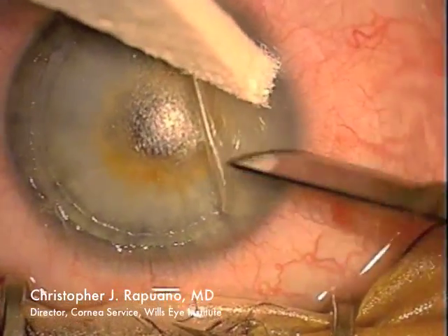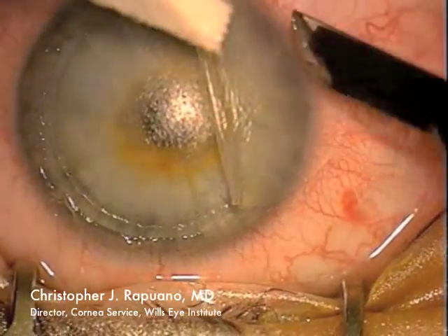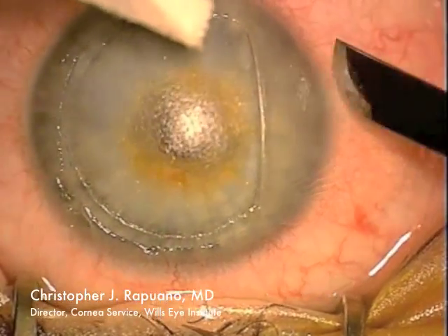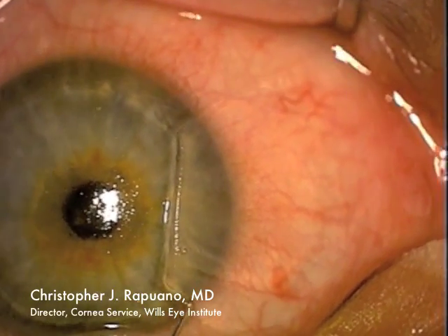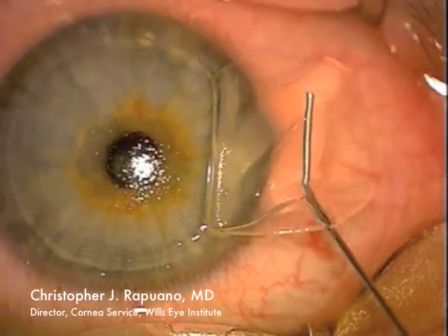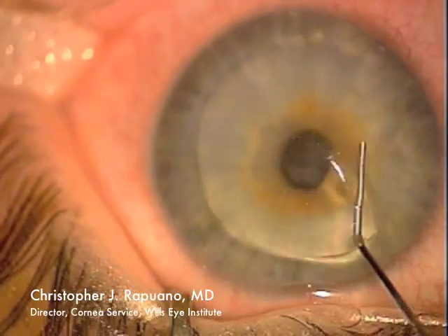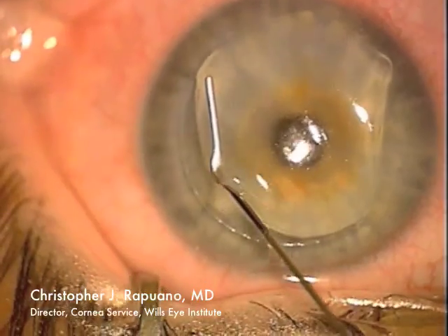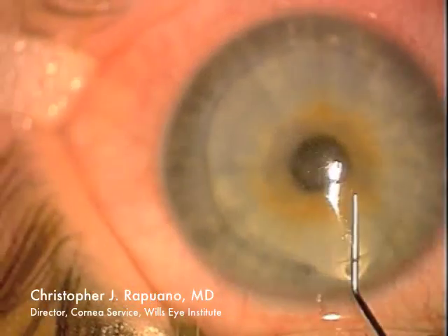It's often difficult to tell when you've removed all the cells, but ideally it looks nice and smooth at the end. I've removed the cells from both sides and I'm going to return the flap to its original position. I irrigate under the flap to remove any residual cells and hopefully keep it nice and clean and free from any debris.